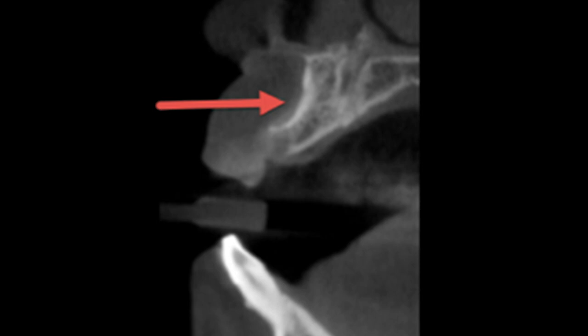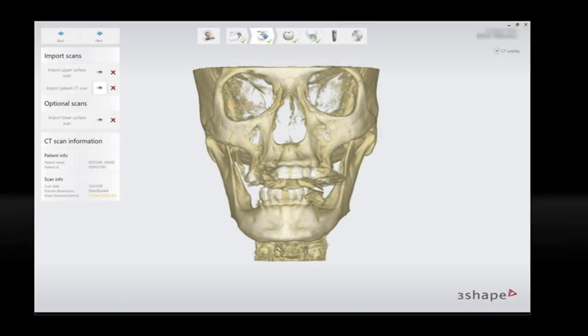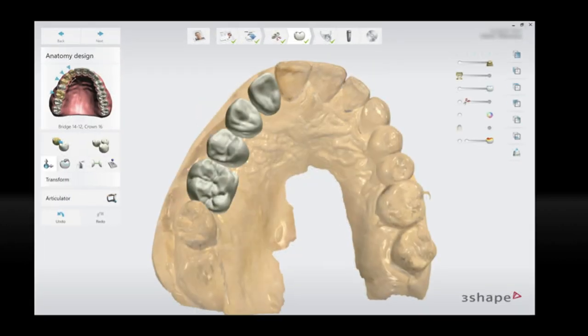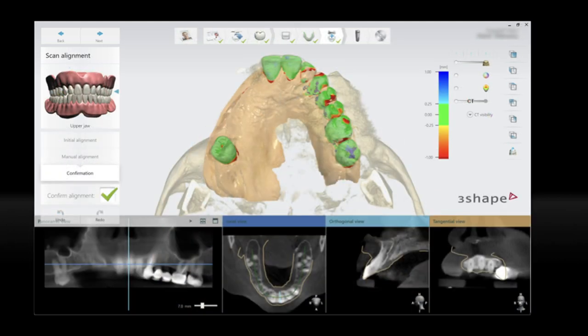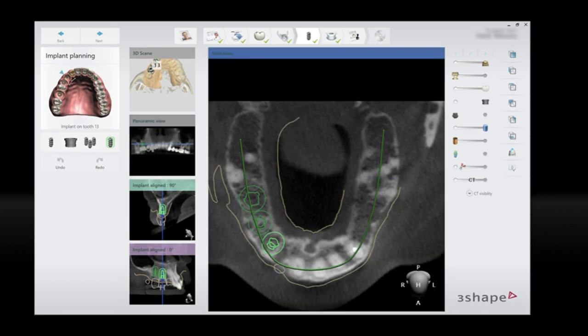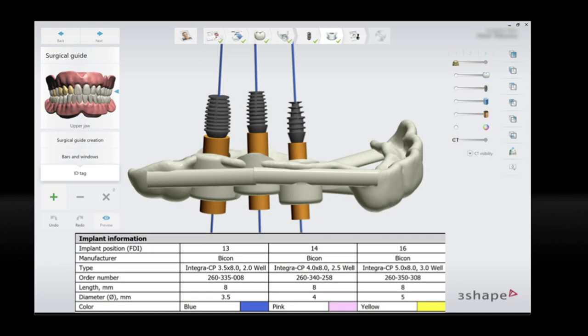So the routine workflow begins by importing the patient's CBCT, importing the patient's STL, and the digital wax-up. Although we have 5 missing teeth, still the edentulous space is just enough to accommodate 4 crowns. Surface registration of the STL to the patient's CT shows accurate alignment and simulation of 3 implants at sites 1-6, 1-4, 1-3. And this is the axial view showing the relations of the 3 implants to each other. The designed surgical guide with implant sizes.